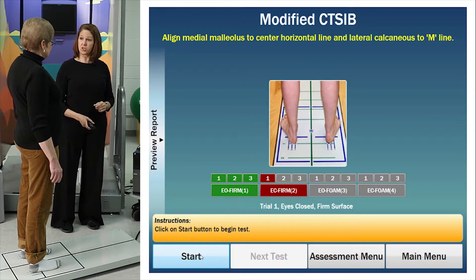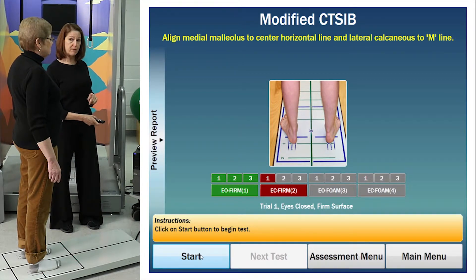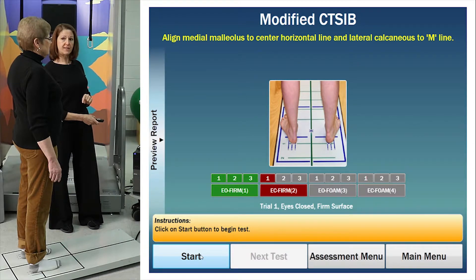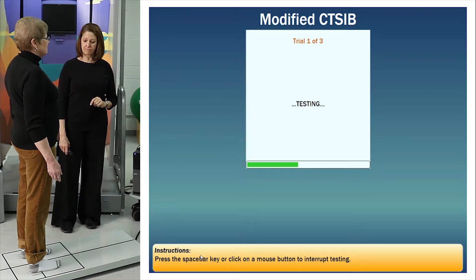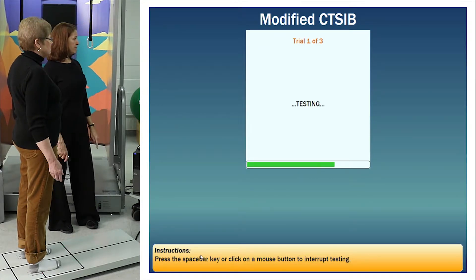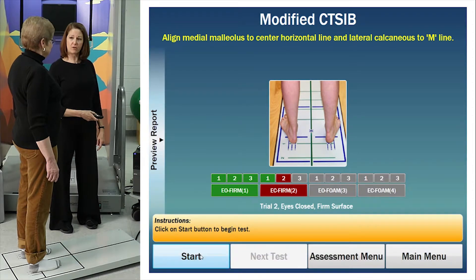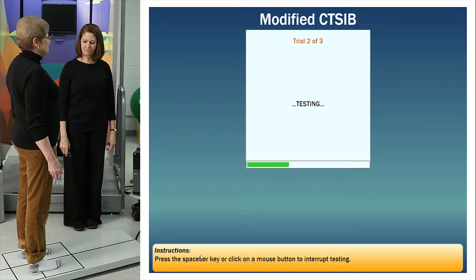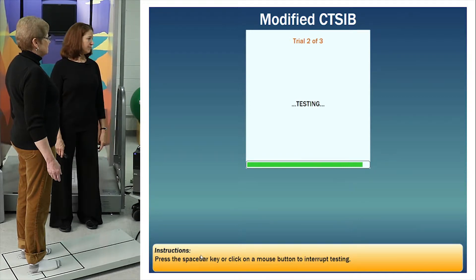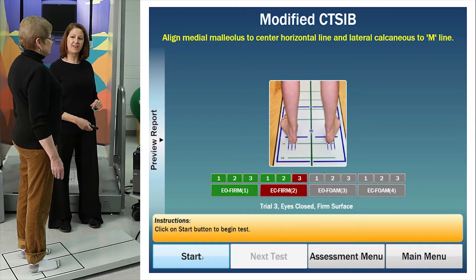For the next condition, you do this exact same thing with your eyes closed. I'll tell you when to close your eyes and when it's okay to open them again. Get ready — close your eyes, and testing. Open. Two more just like that — close your eyes, testing. Open. And one more try — close your eyes and testing.